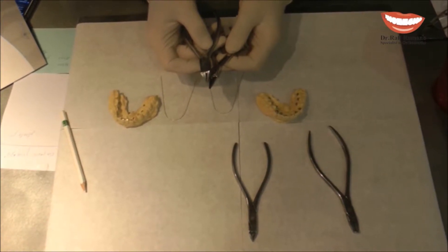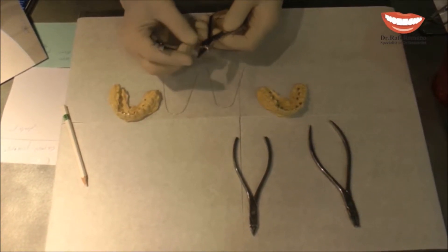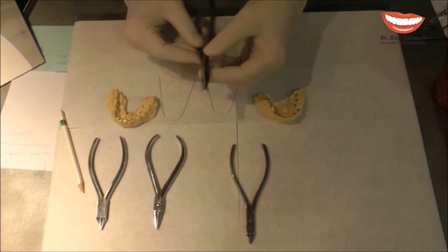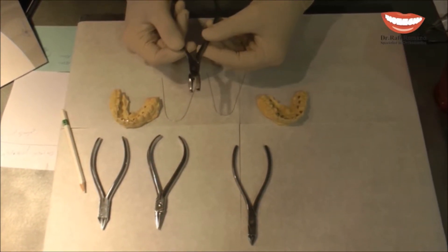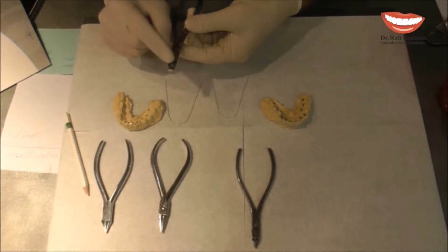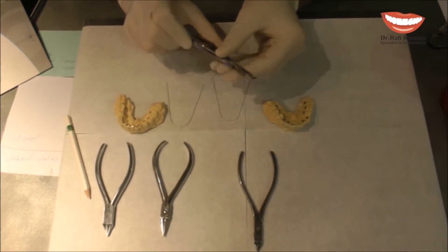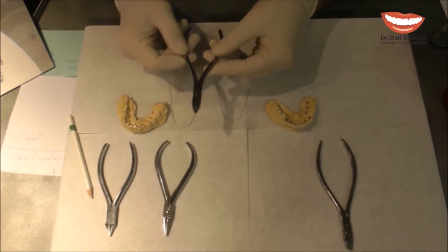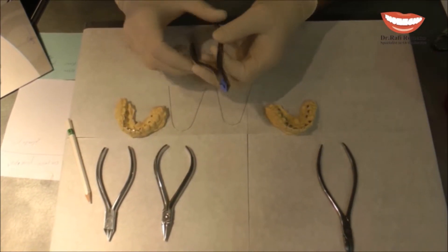This plier is a 140 or 141 depending on the length of the beaks. I also have a distal cutter that is very small and designed for lingual orthodontics, and a small straight wire cutter which I sometimes use as well.